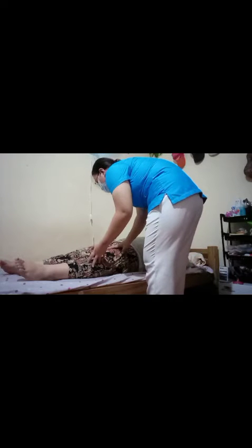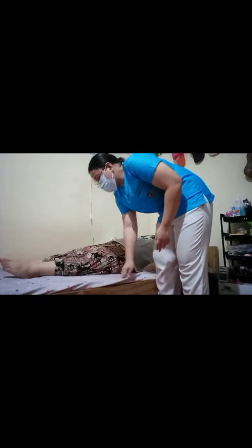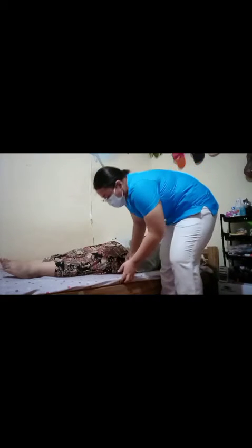So, for the position the patient to align the femur kani to the midline of the IR. So, make sure nga ang patient na to kay nasa midline. So, ma'am, sibukan dali, ma'am. Sige pa, ma'am. Kaya pa niyo po, ma'am. Sibog. So, kana. Assuming that the patient is now at the midline of the table, which is perpendicular to the IR. So, straight lang, ma'am. Relax lang ta, ma'am, ha?